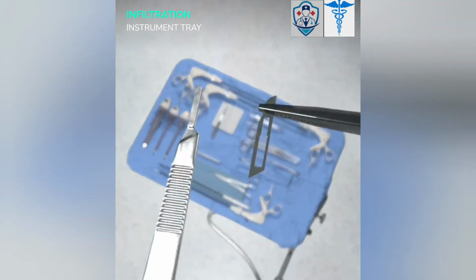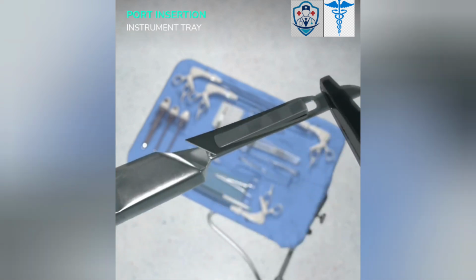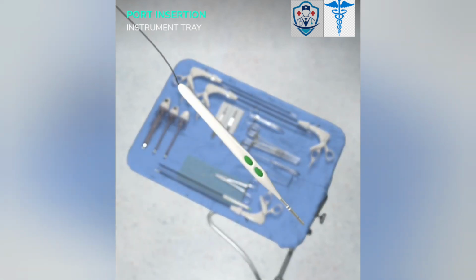The number 15 blade has a small curved cutting edge, used to make short and precise incisions. This blade can be used to incise the skin and anterior fascia for port insertion. The blade must be placed into the blade holder, using forceps before use. The handheld diathermy, also known as electrocautery pen or monopolar, has cut and coagulate modes.